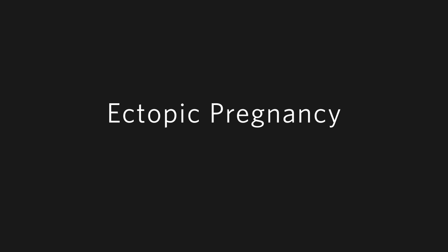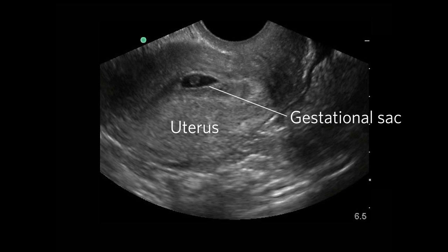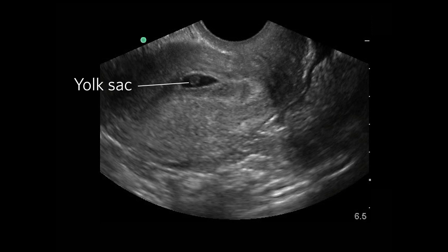Point-of-care ultrasound is very helpful in the evaluation of a potential ectopic pregnancy. Here's the image you're trying to achieve with this scan. In this image, you can see a gestational sac located within the uterus and a yolk sac there within it.